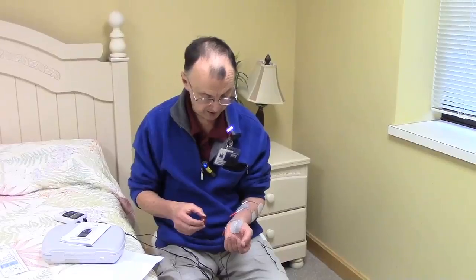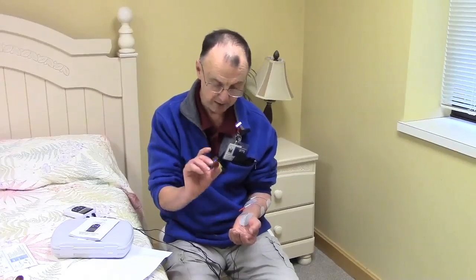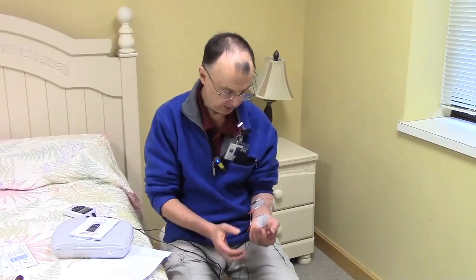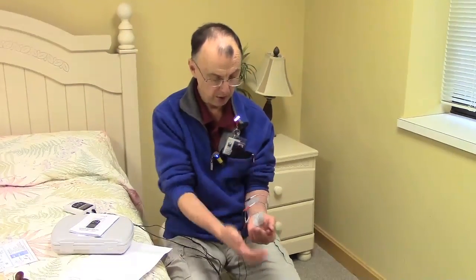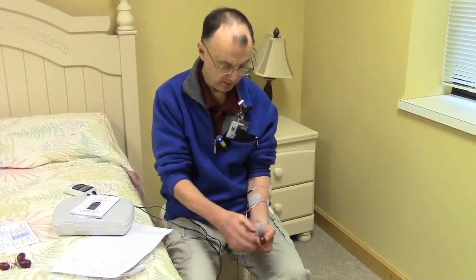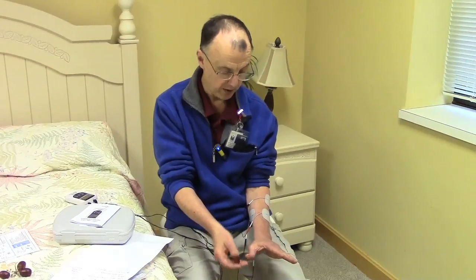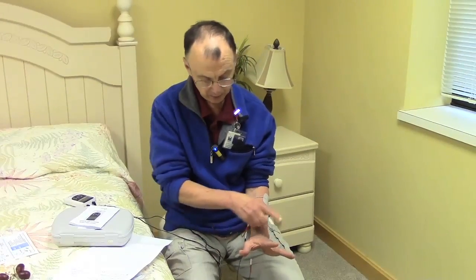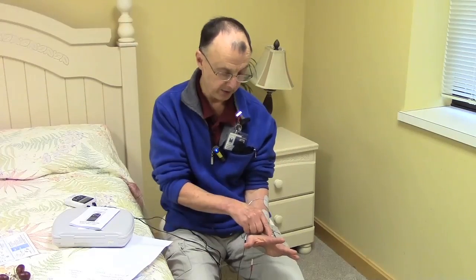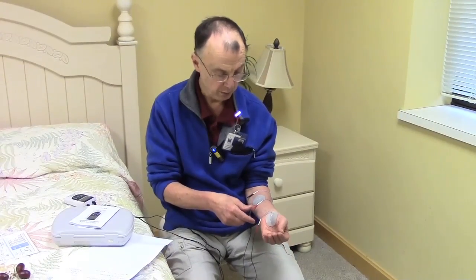If the patient didn't have the biceps to move their hand to their mouth, you could have their strong arm assist, timing it so they're moving toward their mouth and can grasp the food before extension happens. If the timing feels too fast, you may want to set it to six seconds on and six seconds off. The five-and-five is not a magic number, but that's what we've found to work pretty nicely.